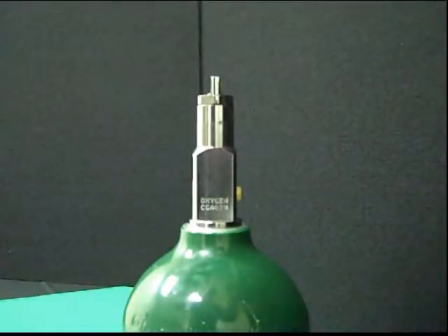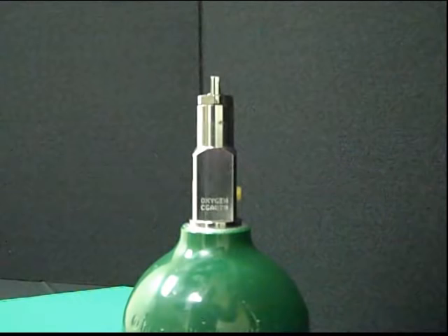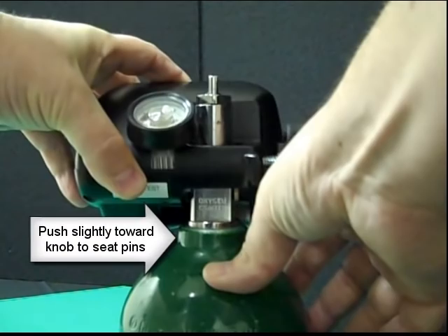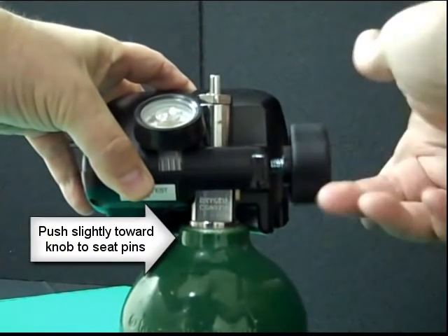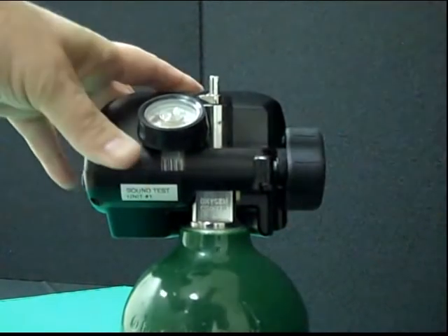To attach the SmartDose gas doser to your cylinder, simply ensure that the knob is open entirely and then slide it over the post valve. Make sure that the pins are lined up with the holes on the post valve. Slide the unit the whole way down and then slowly bring it upward, applying slight side pressure to allow the pins to seat. Tighten the knob to secure the unit.